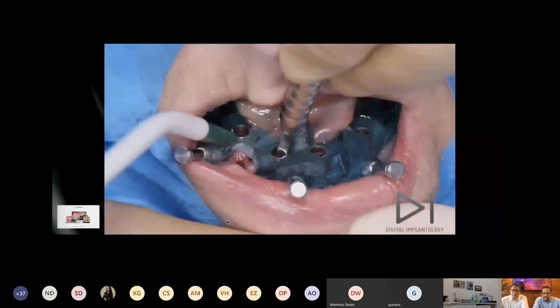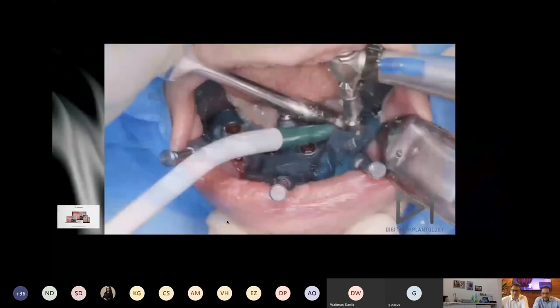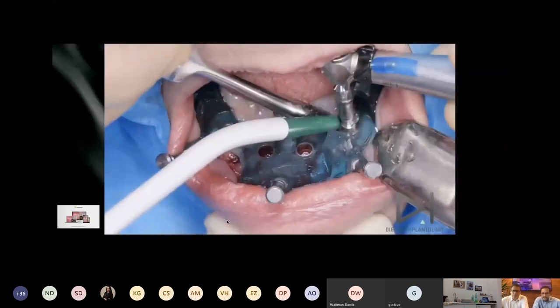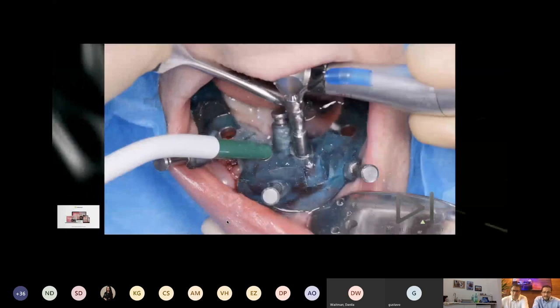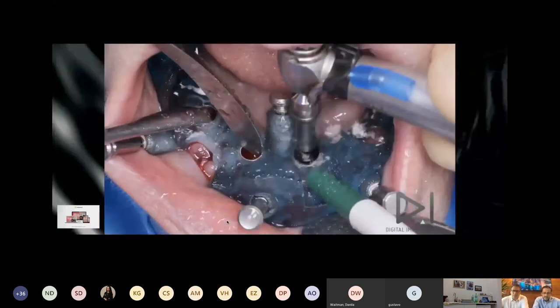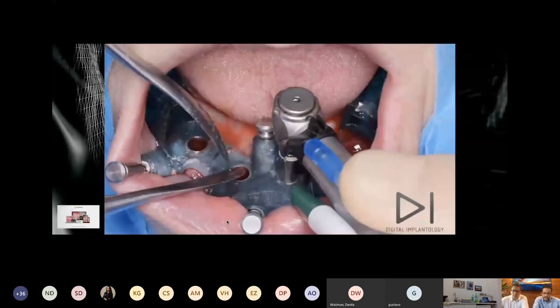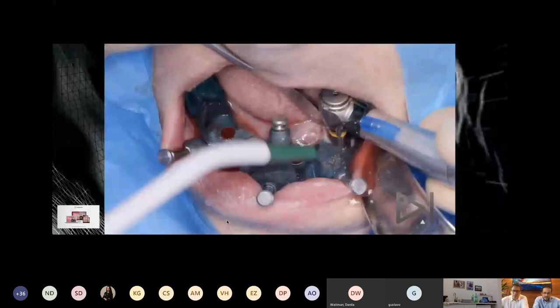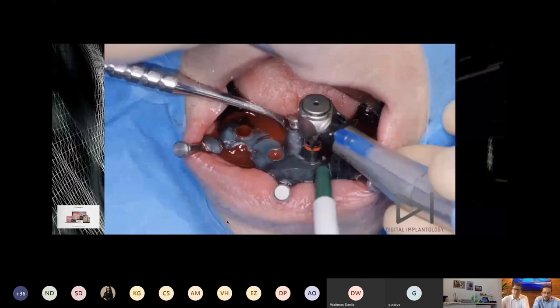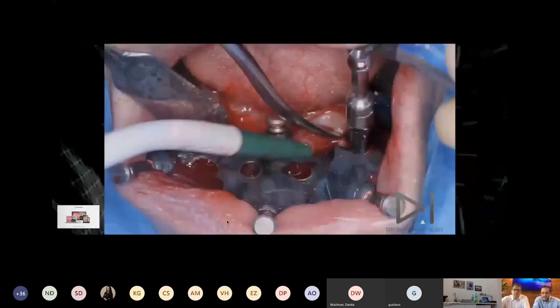Little cut of the gingiva because we have atrophy here. We have the lack of keratinized tissue. And then we start with GSTK. Punch technique, some removal of the crestal bone, white color 2 millimeter drill in all the sides, 2.4 in all the sides, the yellow, 2.8, and then we insert the 3.75 ATID implant.